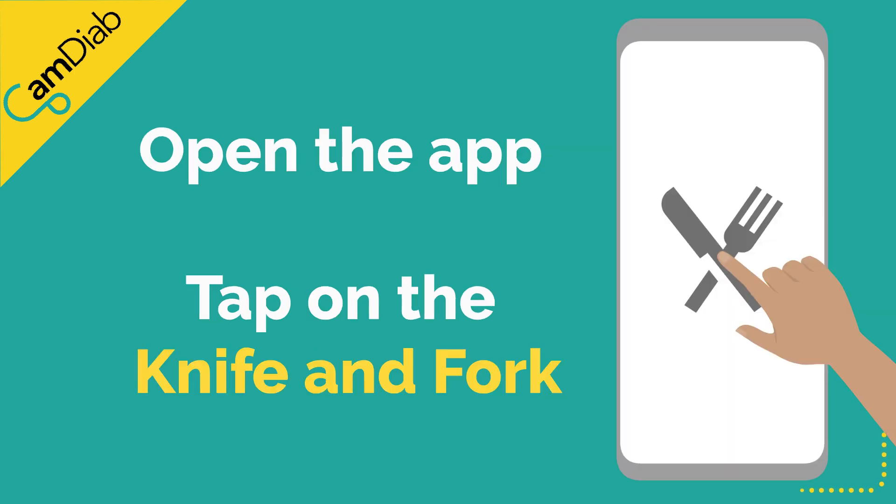To give a bolus, open the app and tap on the knife and fork. The app will communicate with the pump and open the bolus calculator.